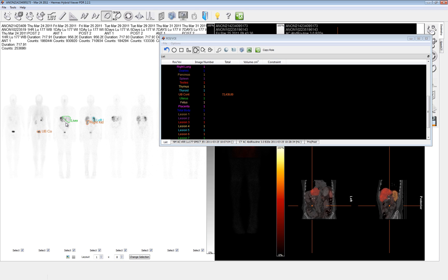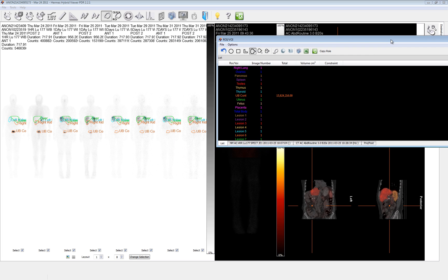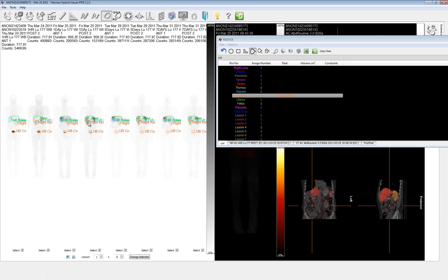And then when we're completed with drawing at least on one everything we want, we just hit the copy ROI button and this will copy the VOIs to the alternate plane, anterior, posterior. It will also copy it to all of the other images. Assuming that the alignment that was done to begin with was actually really good, this should give us a pretty good result, but if we need to edit any of them, it's of course still possible.